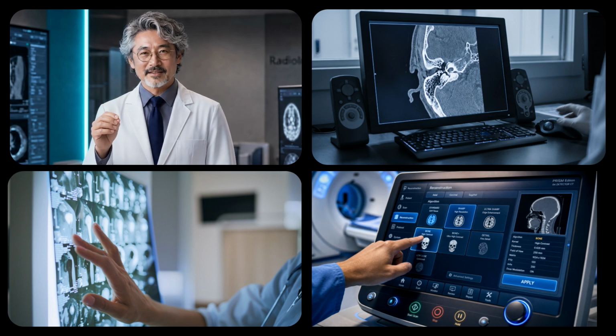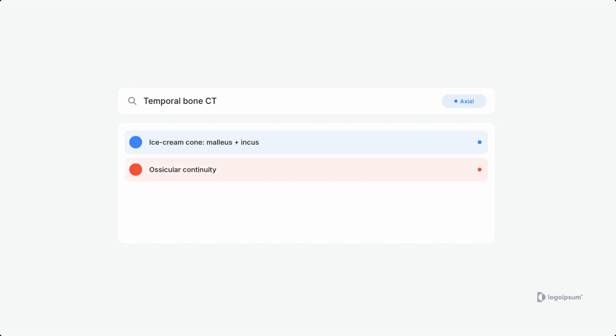Evaluating temporal bone CTs requires systematic review of key anatomical landmarks. Axial planes should display the classic ice cream cone appearance formed by the malleus head and incus body. Technologists must also confirm ossicular continuity, assess cochlear turn integrity, check for semicircular canal dehiscence, and track the bony fallopian canal housing the facial nerve to assist surgical planning.